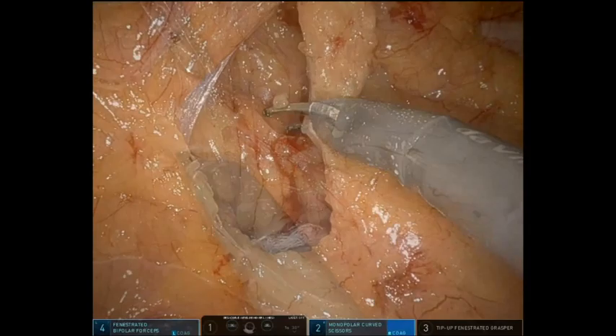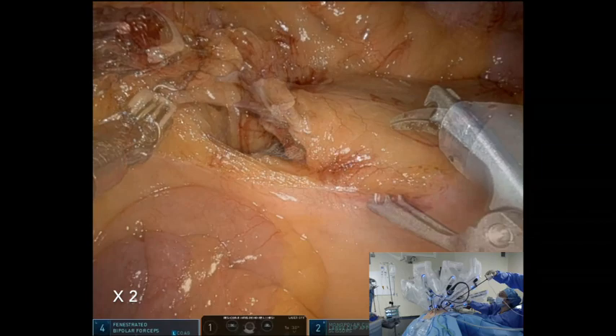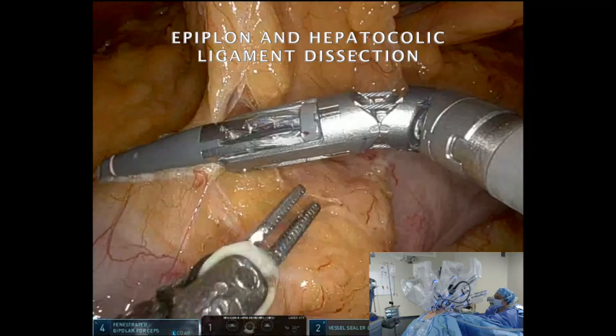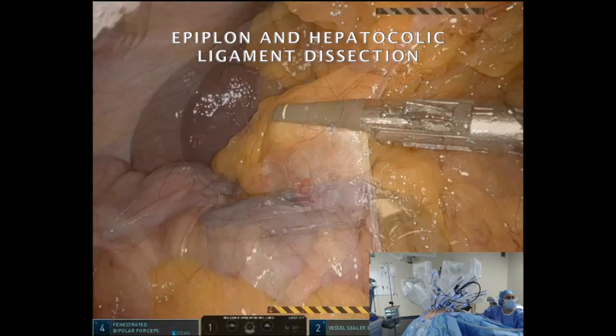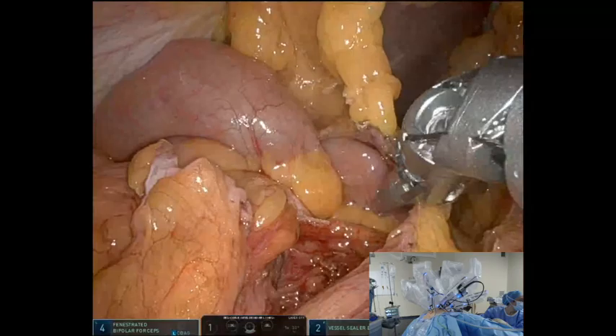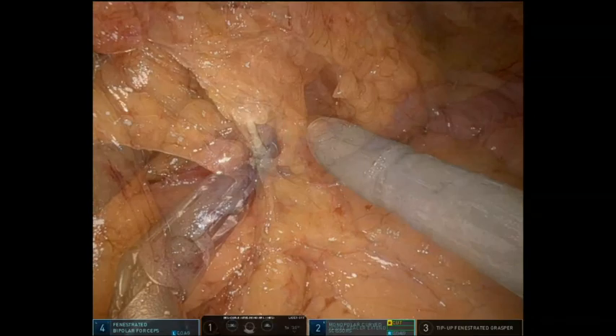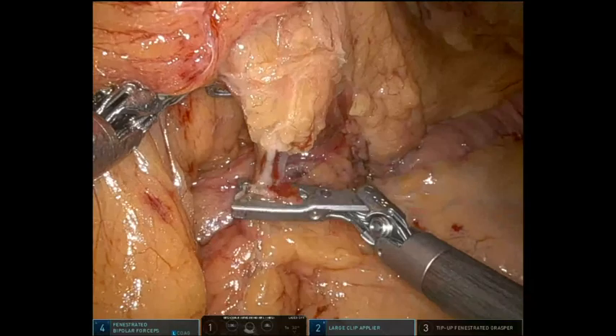Vessels are transected independently after skeletonisation and ligation with Hemlock. Since this group of patients generally have thickened mesenteries and increased vascularisation is frequently present, a vessel sealer is used to divide fat tissue from main vessels. After the complete mobilisation and transection of the right colon, the transverse mesocolon is dissected with a section in between Hemlocks of the right and left branches of the middle colic vessels. Proximal sectioning is not mandatory in this case and could result in functional problems in the post-operative period.